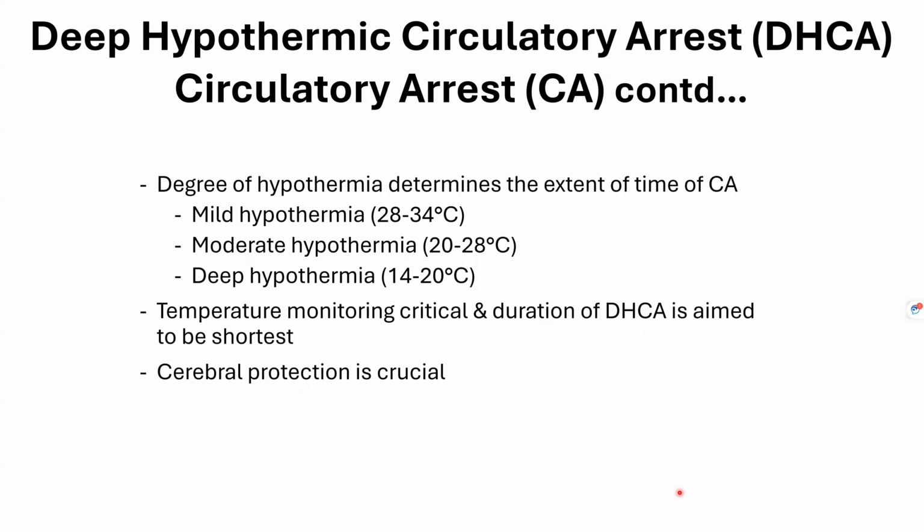So as the name says, it's hypothermia, which means you cool the patient. And when I say cool the patient, you want to cool the patient to the core, not only externally, but the internal core of the patient has to be cooled. And how much the patient is cooled, or to what temperature the patient is cooled, decides how long you can do the circulatory arrest.